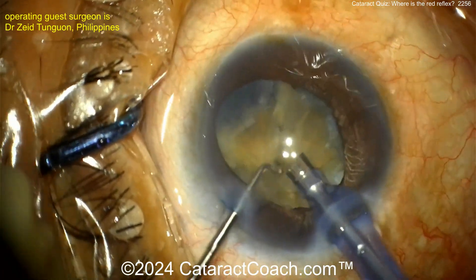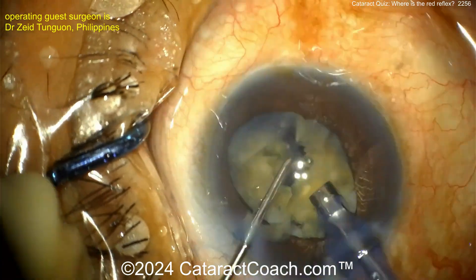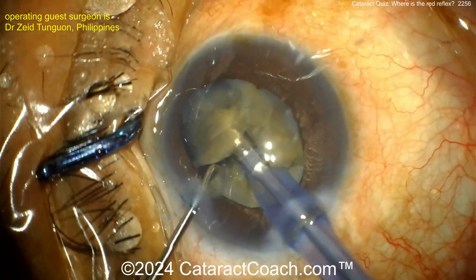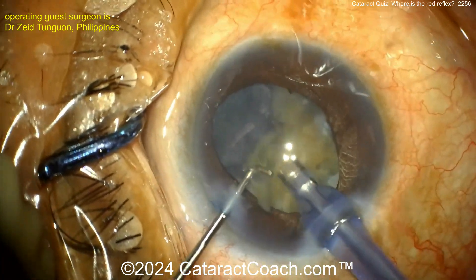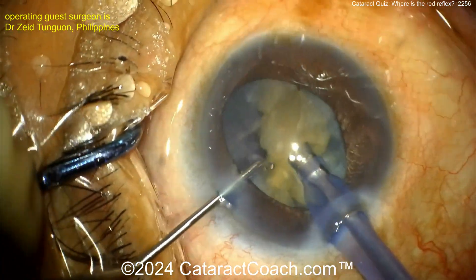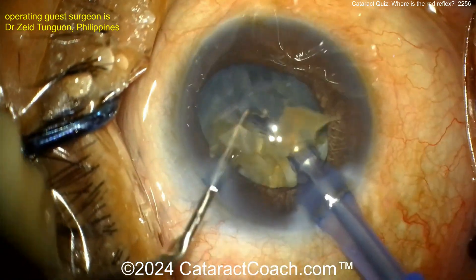You'll also have less of a view to see the posterior capsule, so be very careful with that. Taking down these pieces — aspirate, aspirate — very nicely done. We've sped the video up, so don't feel like you need to operate this fast on a case like this.